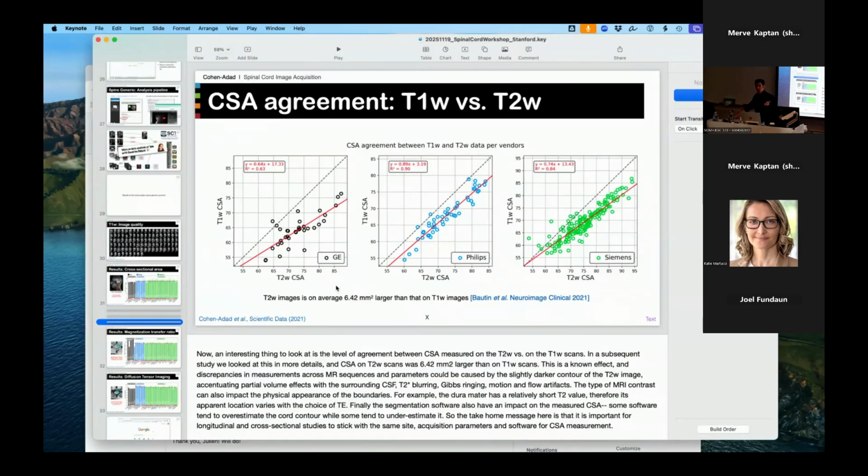René Labounek worked on this with the spine generic protocol, and then Sandrine Bédard and Yann Palochek also worked on extracting normative values, accounting for these covariates. And what we should be doing is also including scanner as a covariate. Yeah, in light of these results, absolutely.